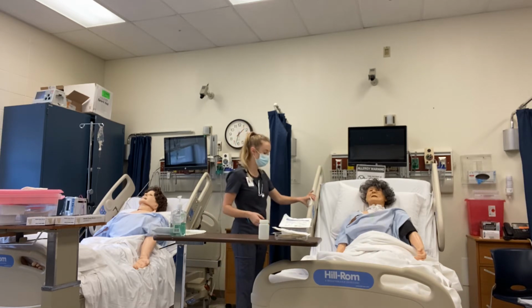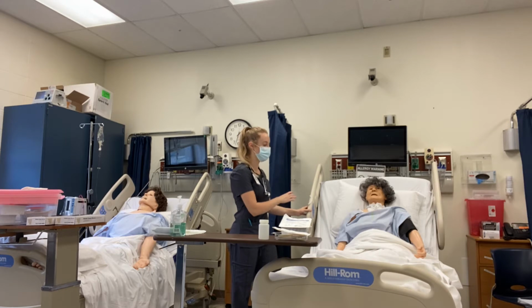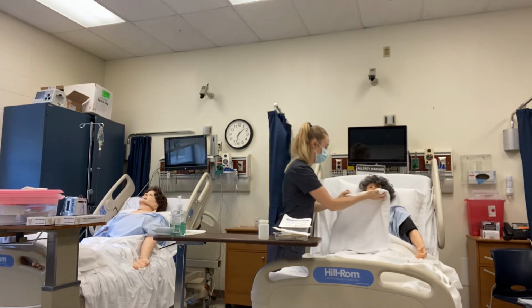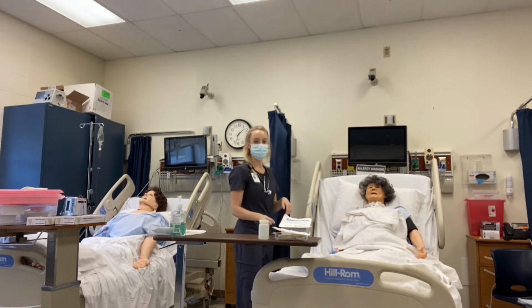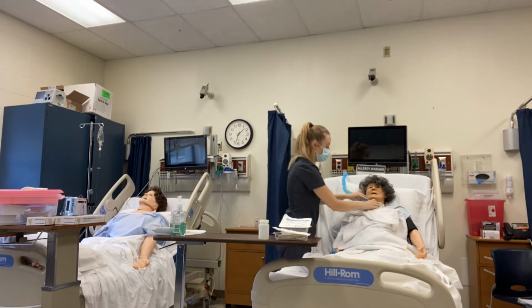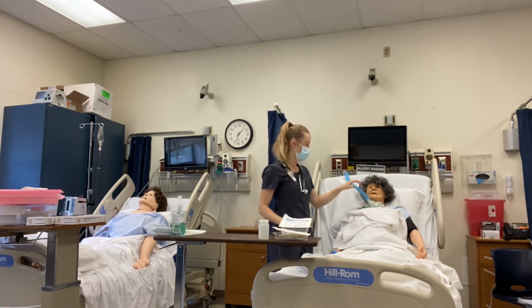Next, I need to make sure that my patient is at waist height and that she is sitting forward. I'm going to give her a towel while I do this suctioning, just so I don't get stuff all on her. I want to make sure that my patient is hyperoxygenated. So I'm going to make sure that she has the oxygen on before I start my suctioning, so that those oxygen saturations are okay.